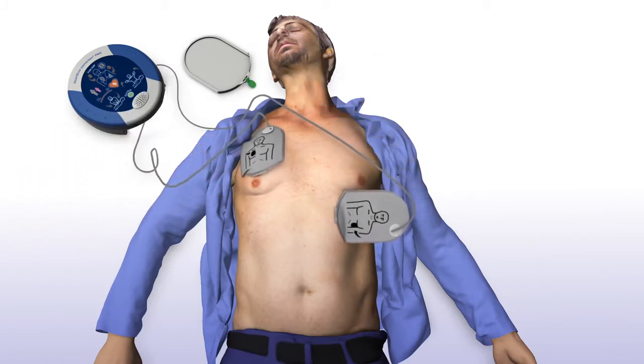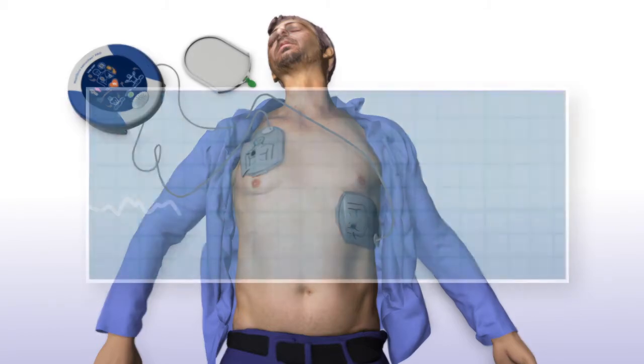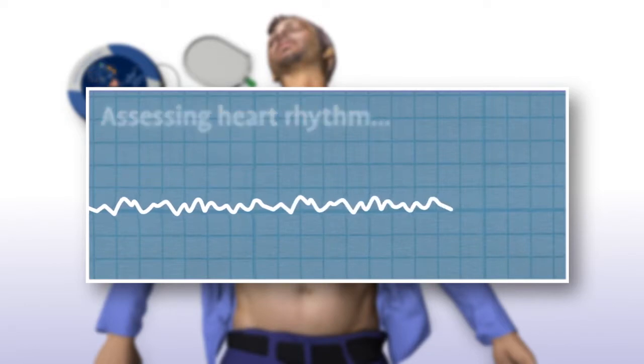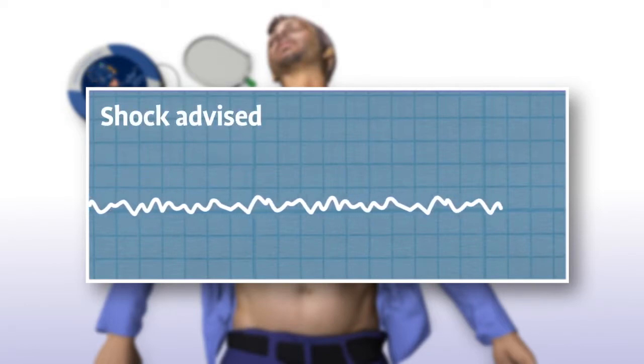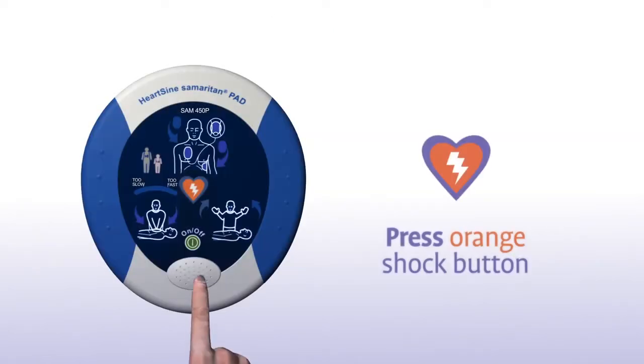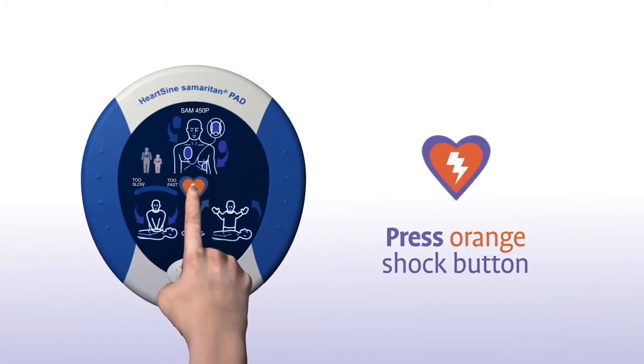Press pads firmly to patient's bare skin. The Samaritan PAD automatically assesses the patient's heart rhythm and recommends whether or not a shock should be delivered. Shock advised. Stand clear of patient. Press the orange shock button now.